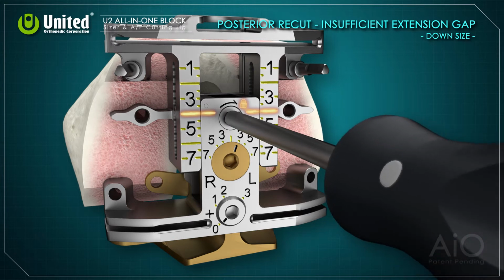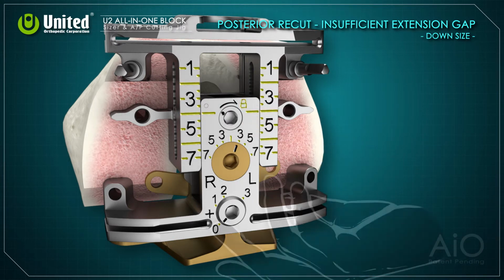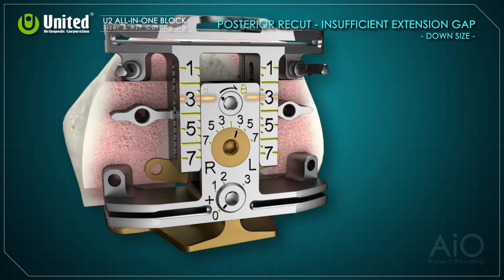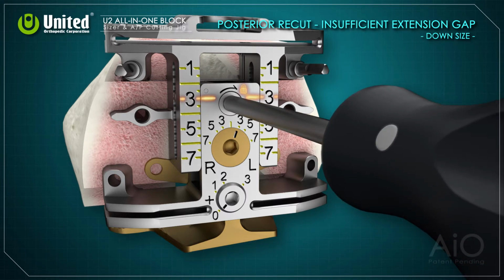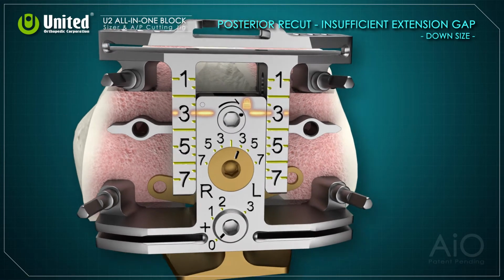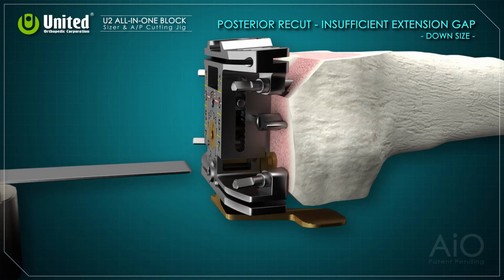Rotate the upper knob to unlock the chosen size, and slide the posterior cutting slot to readjust the main panel scale from the original size 4 to match the smaller size 3. Rotate the upper knob to lock in the new chosen size. Secure the posterior cutting slot with threaded pins and redo the posterior cut.